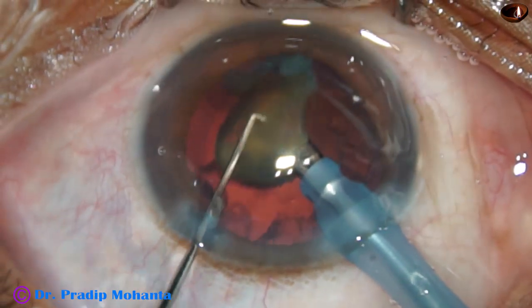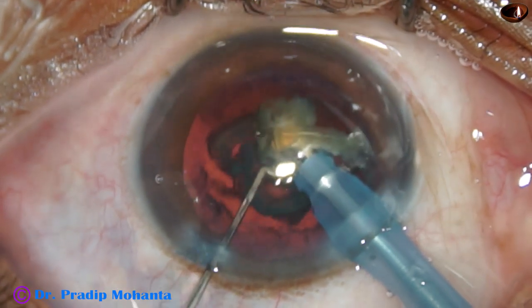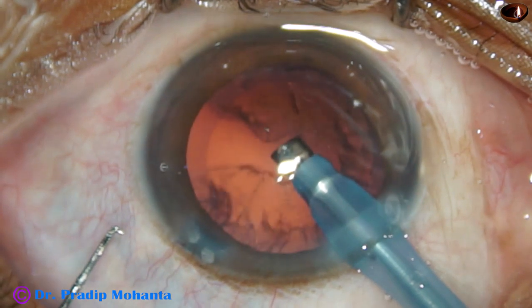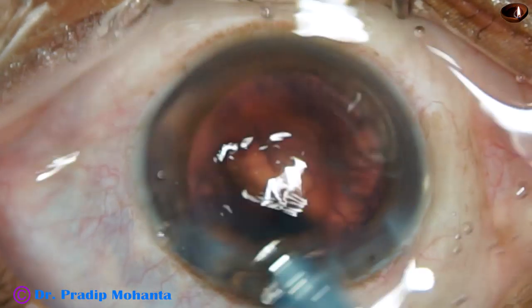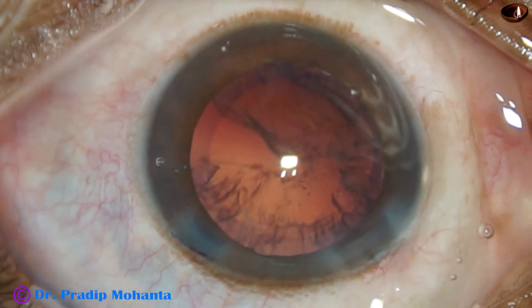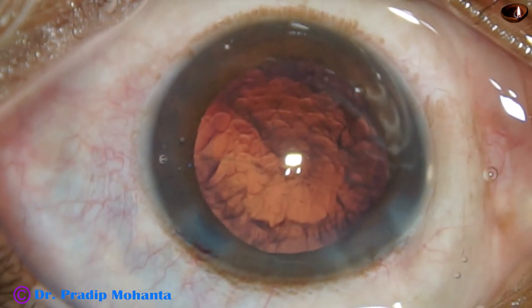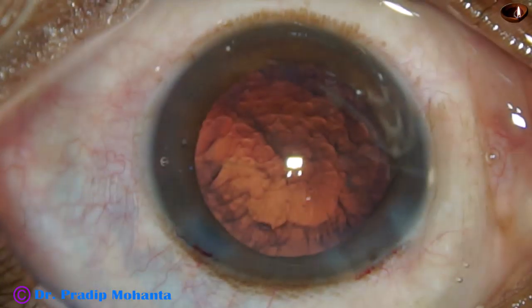This is the last nuclear fragment. At this time we can decrease the vacuum, but in this case it was not necessary. The anterior chamber is very nicely formed. There is no trampoline effect of the posterior capsule and it is almost done. The nucleus has been managed. A little bit of viscoelastic is injected to keep the AC formed while the cortex is aspirated.